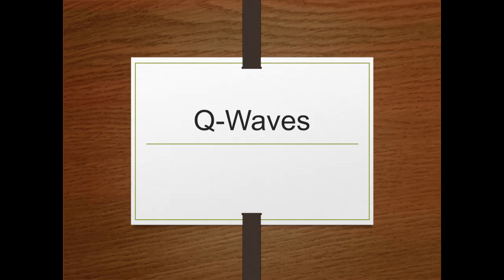The thing we're going to talk about this week is Q waves, and we should pay attention to Q waves because sometimes they're significant, sometimes they're not significant, sometimes they're normal, sometimes they're not so normal. So let's get into Q waves briefly.